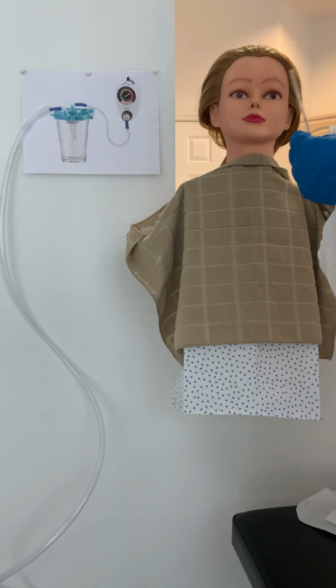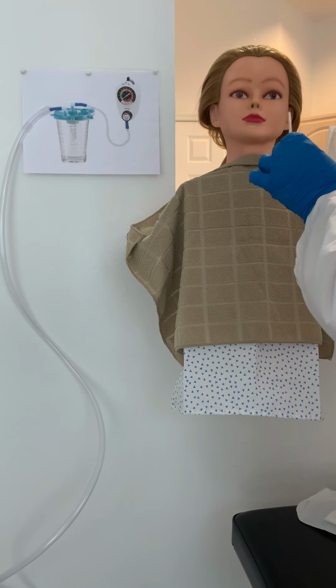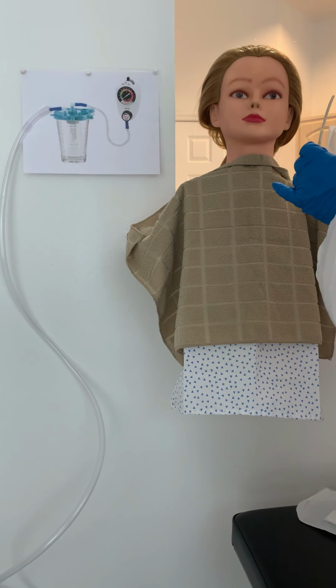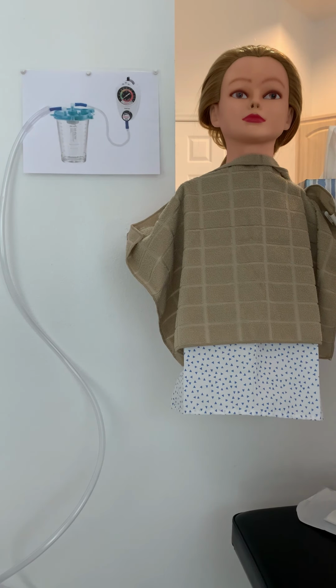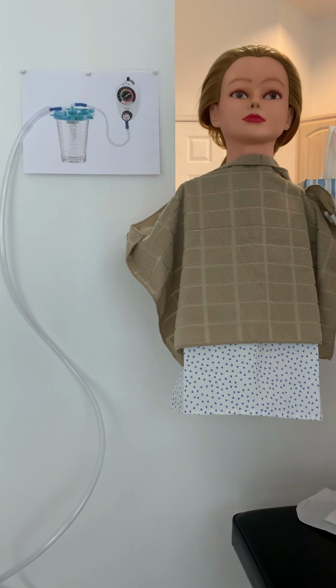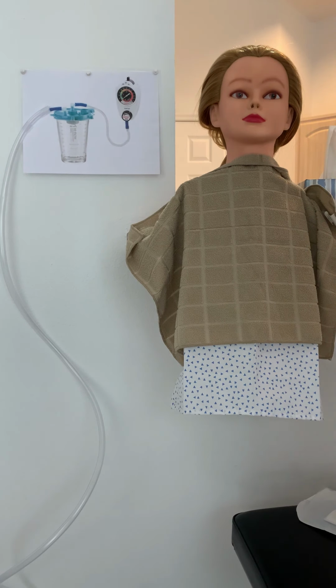All right, Mrs. Harper, I'm going to put this in your nose. When you feel it in the back of your throat, please let me know so I can look in your mouth and make sure it's going in the right place. And then I'm going to have you tip your chin down to your chest and take some swallows of water. Okay, that's going to help the tube go down easier. In fact, let me give you a swallow of water before we start. Okay, you feel like you're swallowing okay? All right, so I'll just advance the tube with swallows once we get to that point.